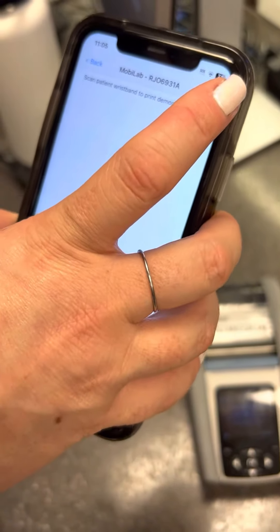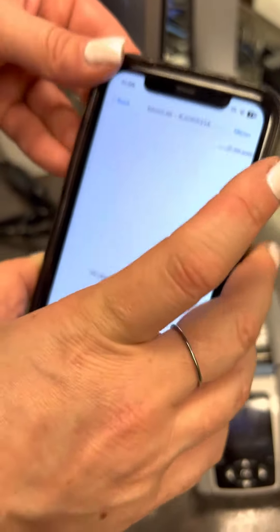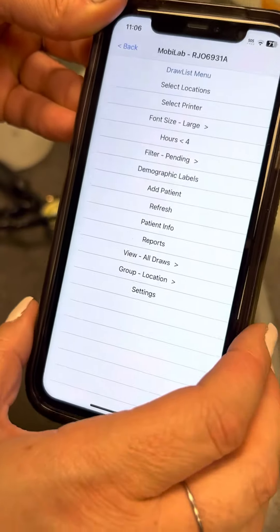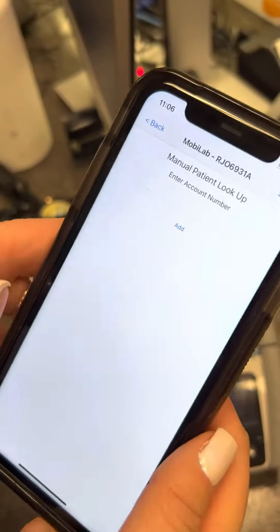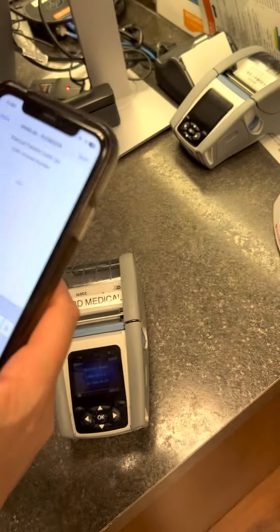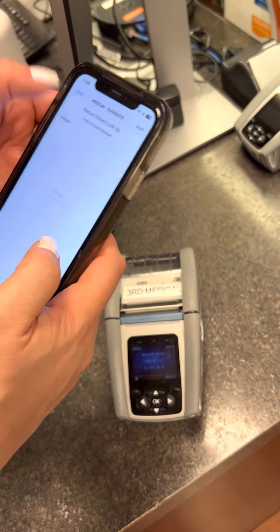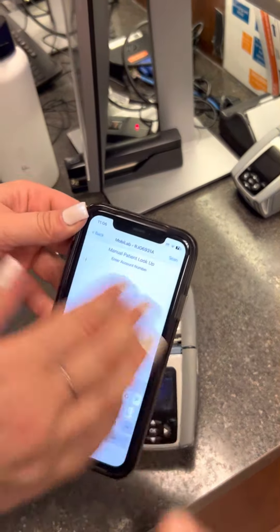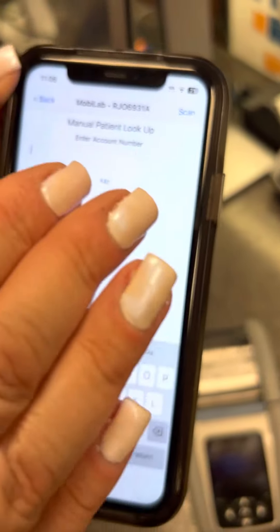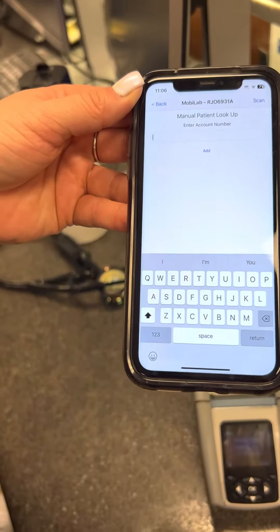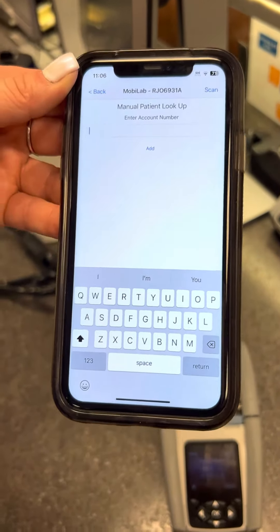You scan their wristband. Generally you'll be assigned to your patients and it'll pull them up. I'm assigned to my patients but mine don't have any labs ordered, but it'll pull up the labs for your patients. You can also type the name in of the person to search.